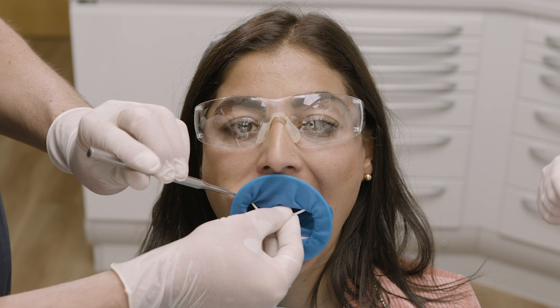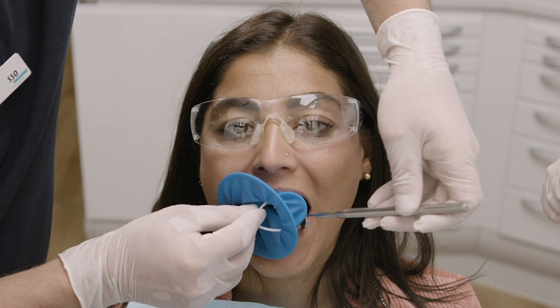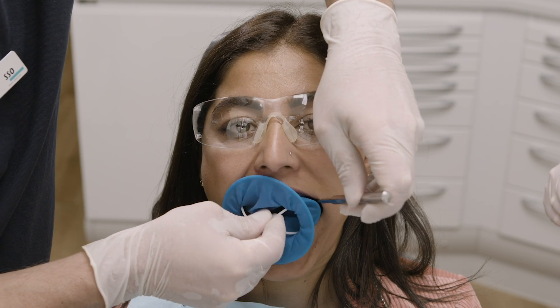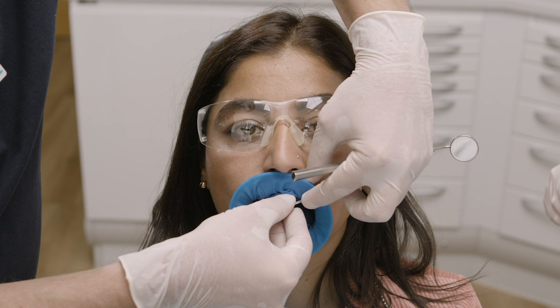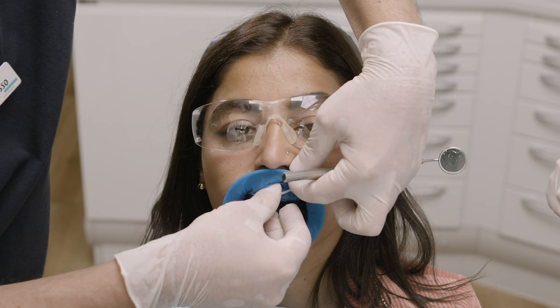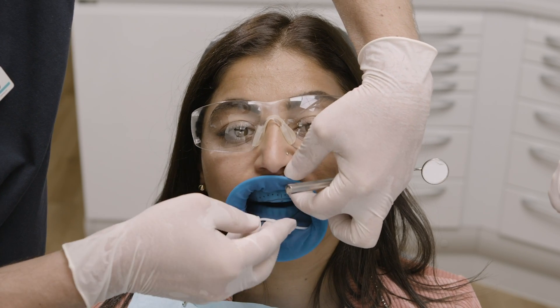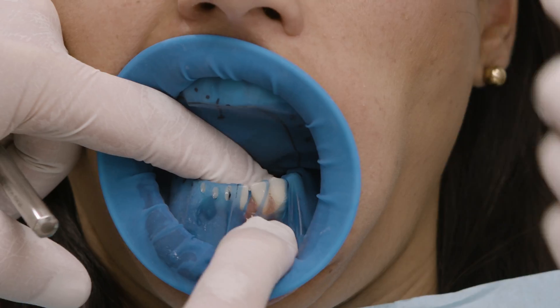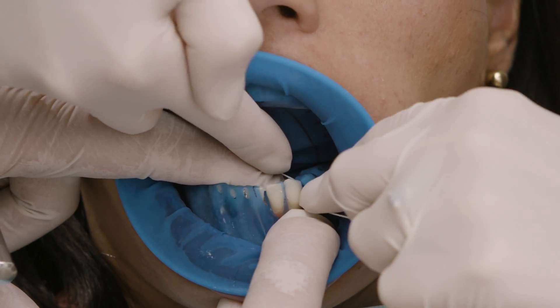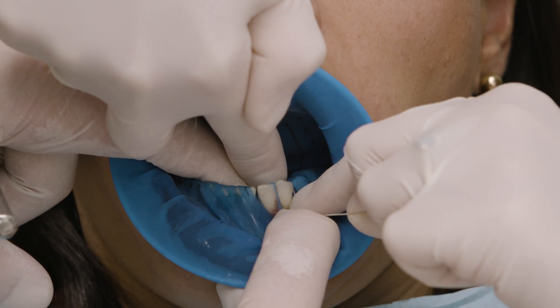Optradam can also be used for the anterior region without clamps. The individually punched holes ensure that the dam is optimally stretched for proper tooth isolation. Secure Optradam cervically and pull it towards the oral aspect. Proceed from mesial to distal and use dental floss to overcome the contact point.